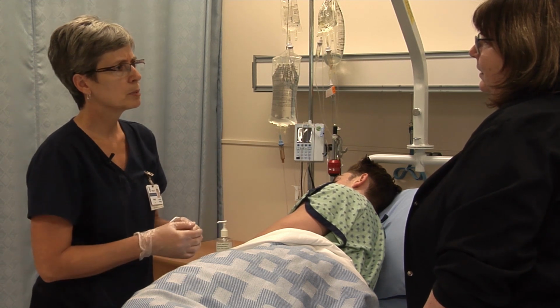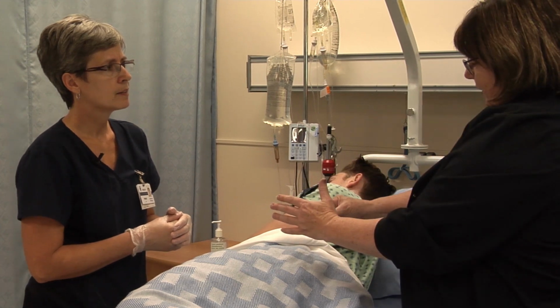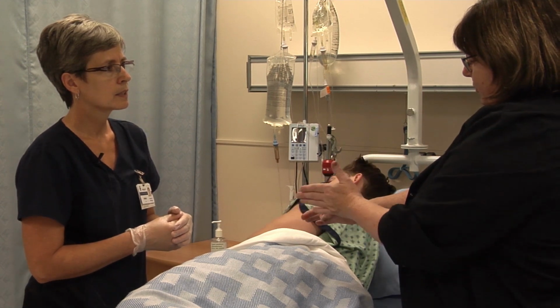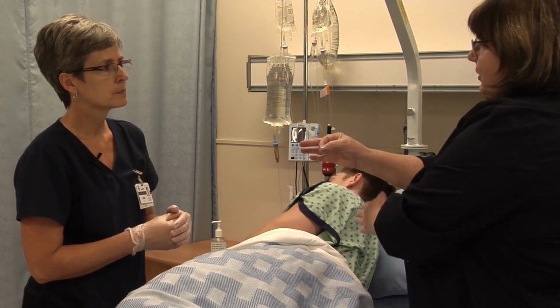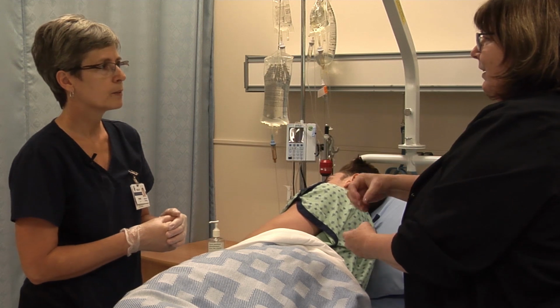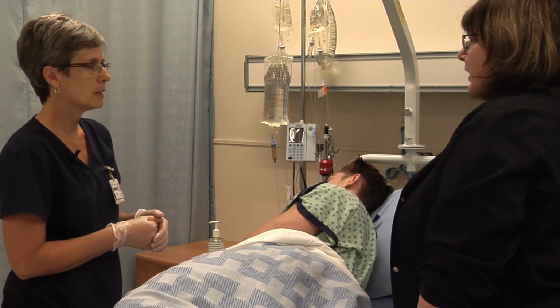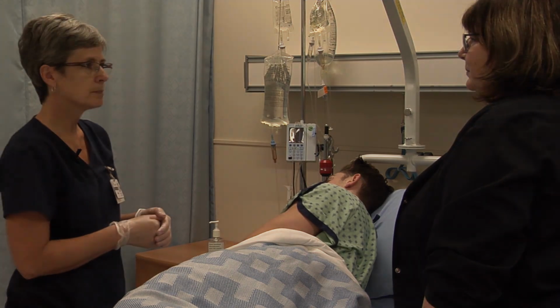Yeah. What do you do in your practice? Do you let the Z go? Yes, you can let the Z go because you've pulled it over and you've got the needle in it. So when you push it back, as soon as you're pulling out, the tissue will move over. Yeah. So the whole thing is to think of the needle going down as a well. Right. And the tissue will move back over top of it. So that's okay to do that. Okay, great.